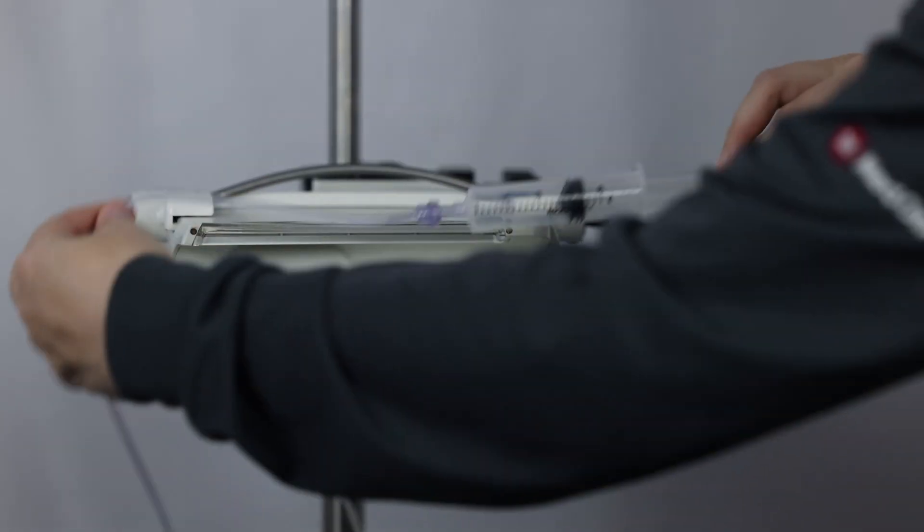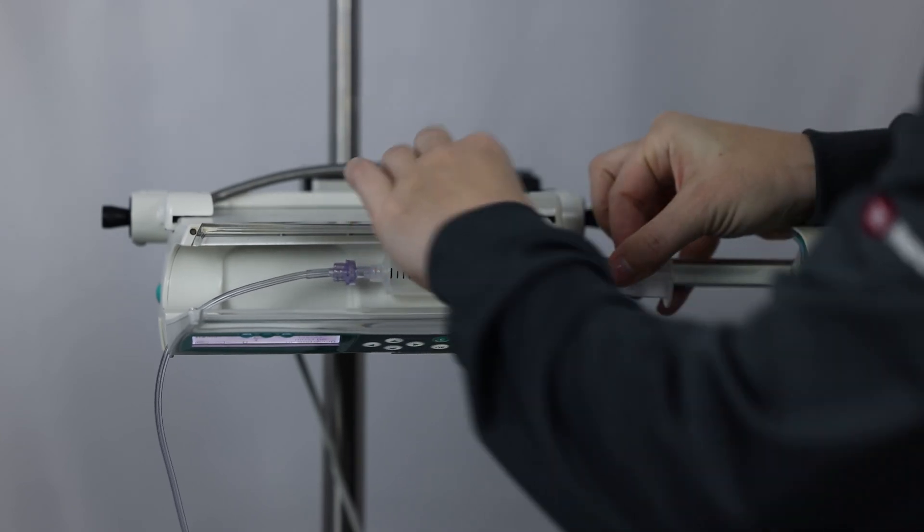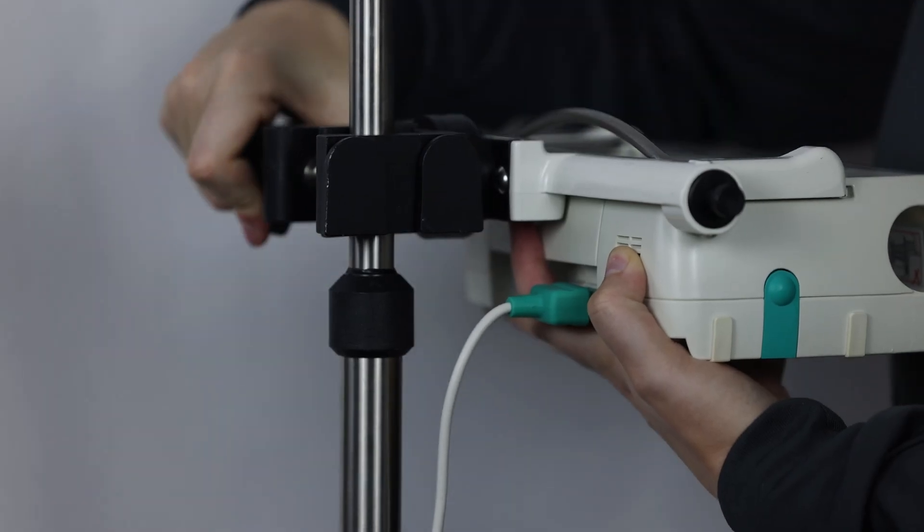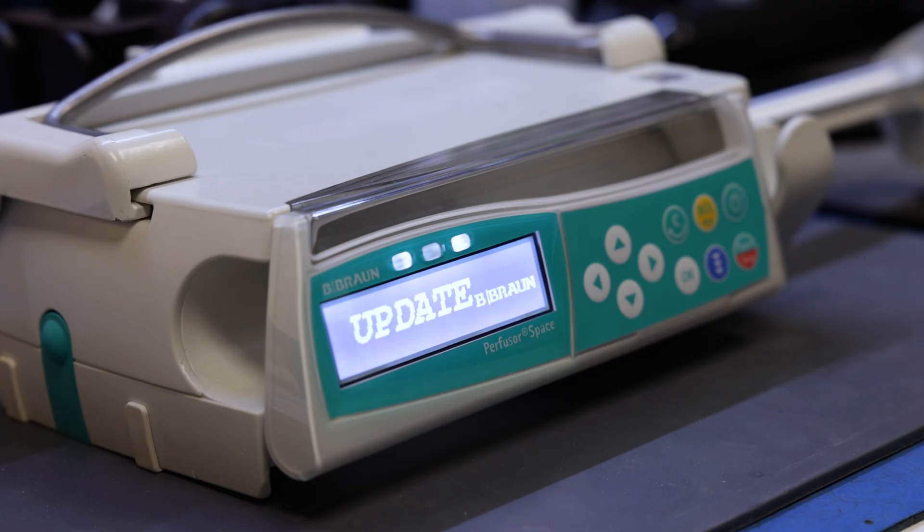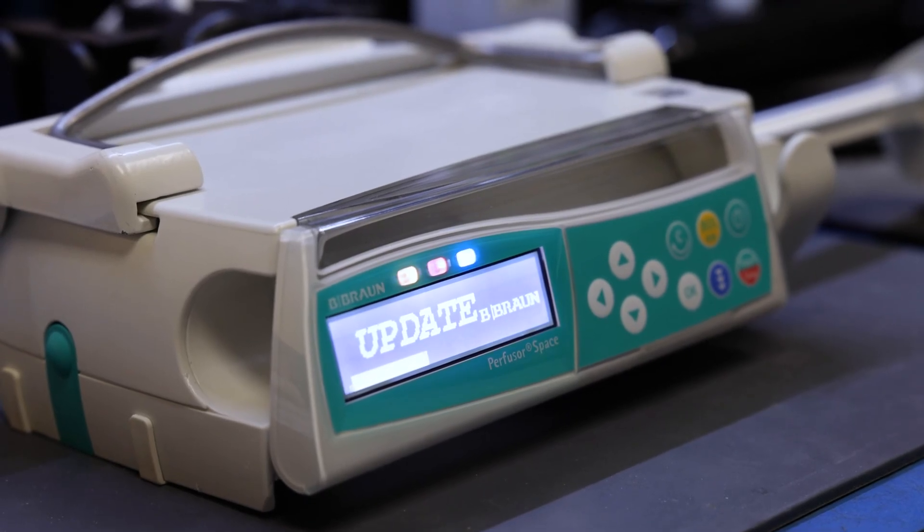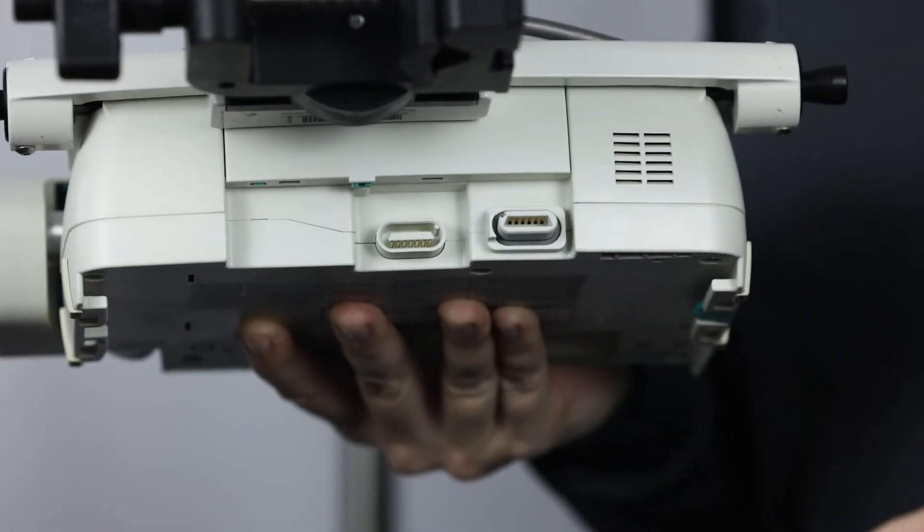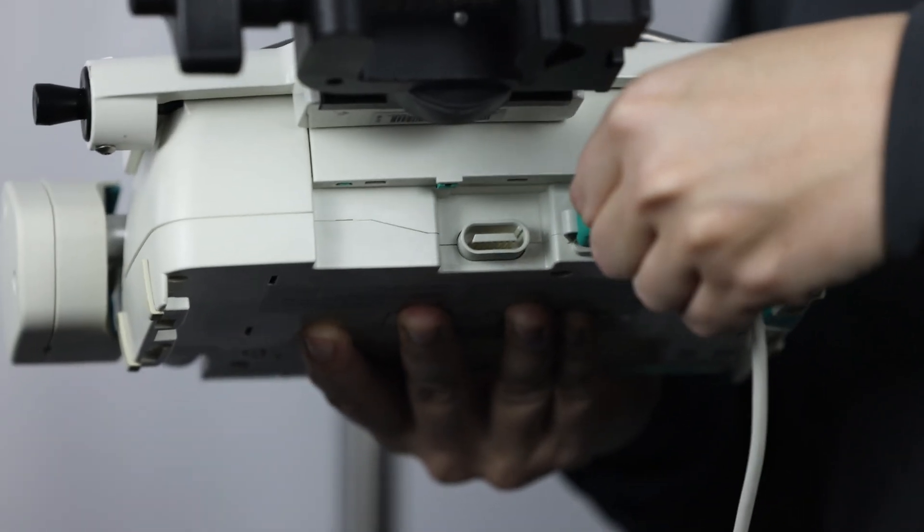One of the smaller syringe pumps on the market, the Perfuser Space only weighs 3 pounds. The pump can be attached to an IV pole with the adjustable clamp, and up to 3 pumps can be stacked together. The bright screen and arrow keys allow for accurate programming. The internal backup battery on the B. Braun Perfuser Space can last up to 8 hours.